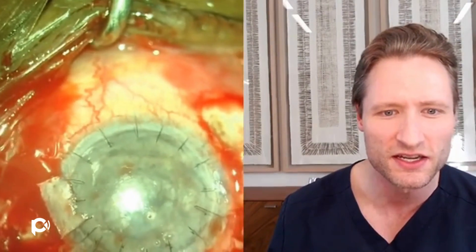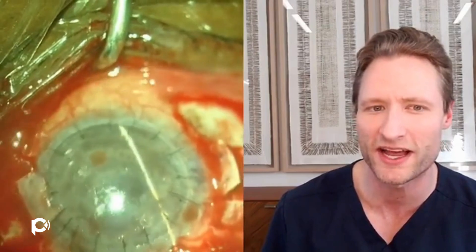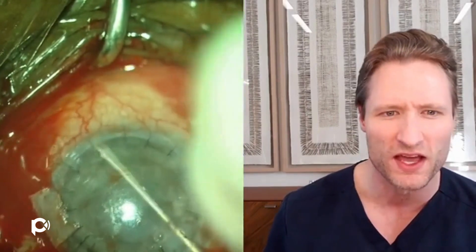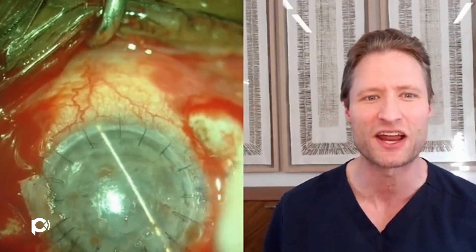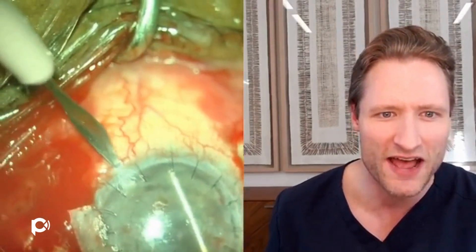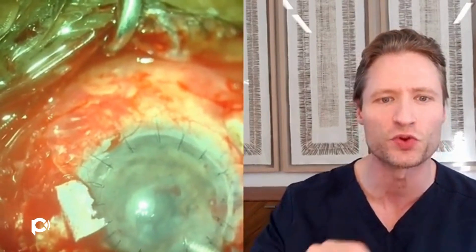I'll make a paracentesis and put a dispersive viscoelastic into the anterior chamber. After the anterior chamber is more or less maintained with the viscoelastic, I can use a cyclo-dialysis spatula to try to recreate something of an angle. You'll notice how much resistance I'm encountering with the spatula — this is because there is so much fibrotic membrane, anterior synechiae, encasing the iris at its root and fused through the iris to the capsular rim. Once I'm certain that I have a space in the anterior chamber, I'll make another paracentesis and use it to sweep along and verify that I have a deep angle 360 degrees around.